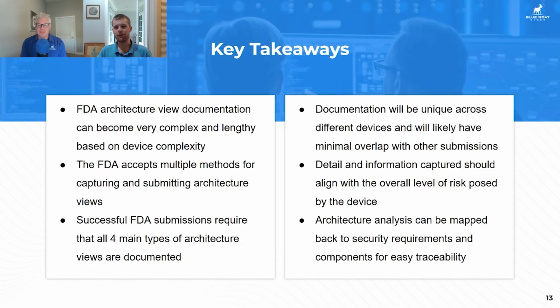It's essentially moving part of that over onto the clinician or onto the therapist, who should act as the final stop and the final decision maker throughout the process. If a device itself is making the decision, then that device essentially has to inherit the responsibility if it makes the wrong decision. This is why these considerations can be extremely deep for, say, IVD machines, where they're often trying to actually make a diagnosis compared to something that is providing clinical decision support.